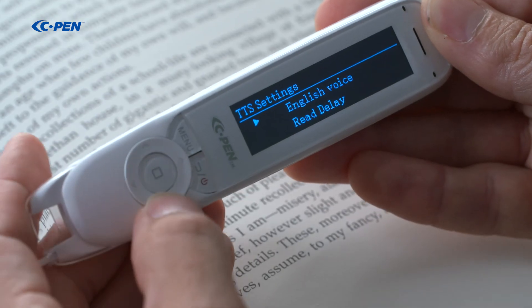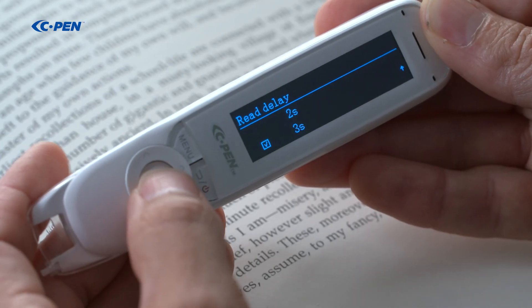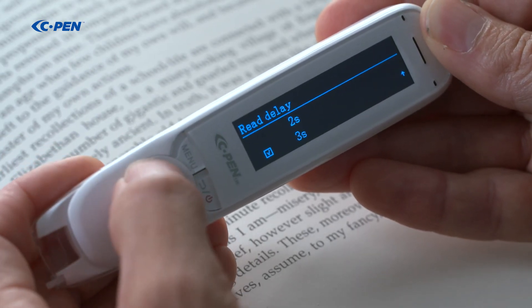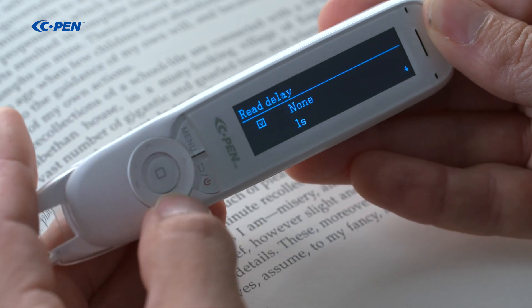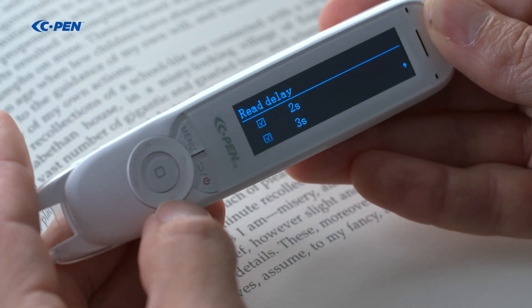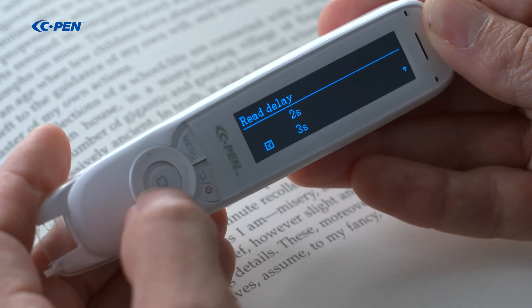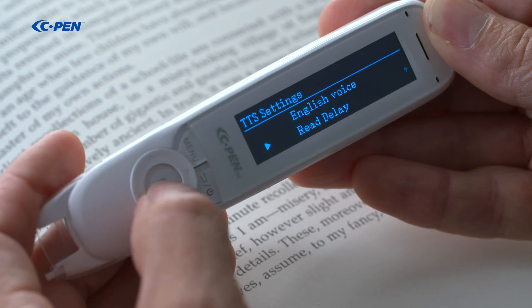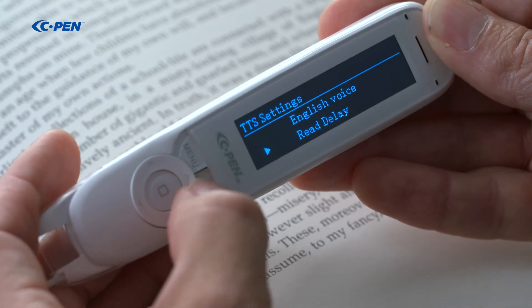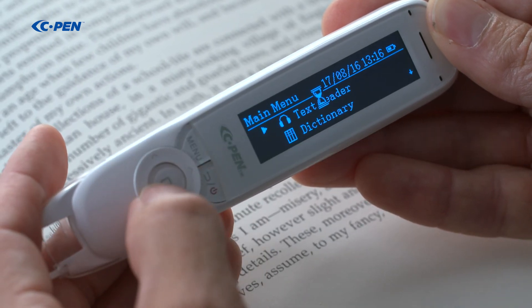By default, reading starts immediately when a scan is finished. With Read Delay, it is possible to add a delay between scanning and reading, which allows you some time to shift focus from the process of scanning text and listening to it.